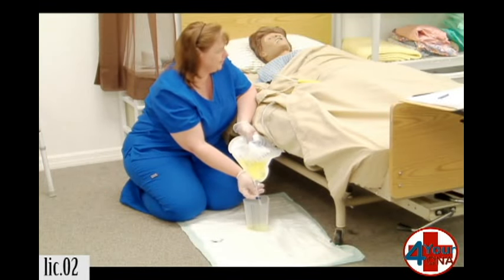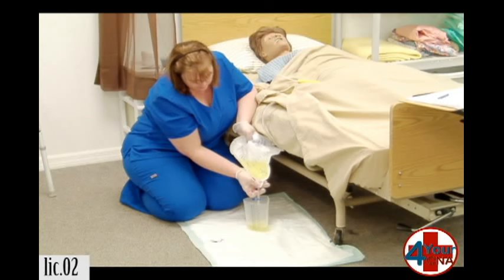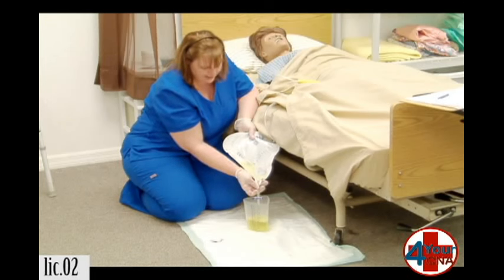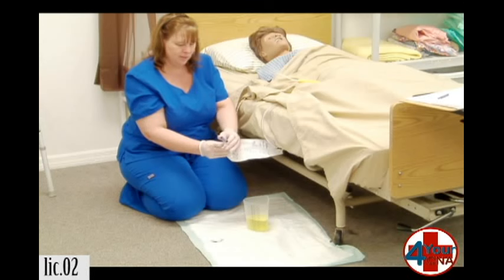Ms. Jones, are you doing okay? And we're going to empty the urinary drainage bag. I need to keep this port very steady so it doesn't touch the inside of the container or anything in the environment. Once it's stopped draining, I'm going to close the port.